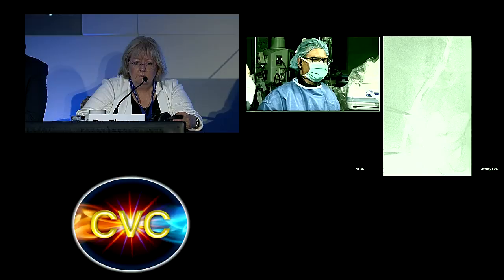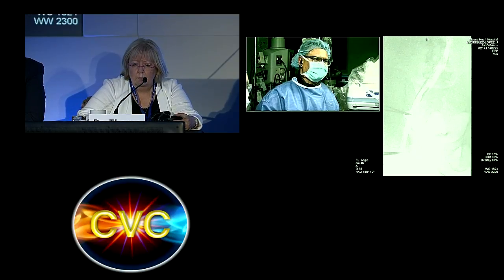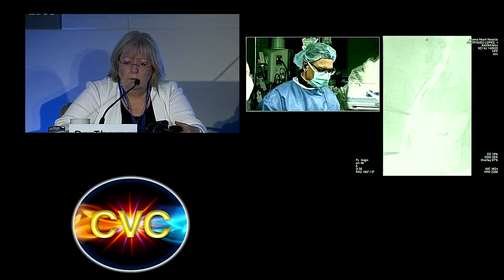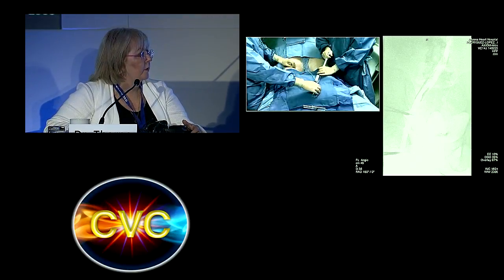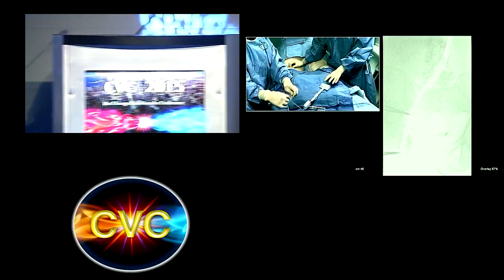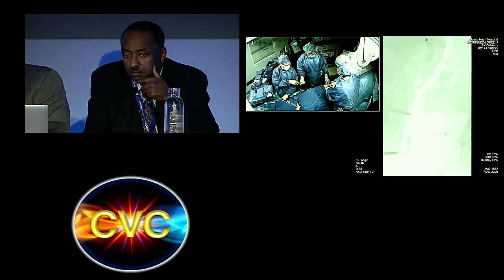It did fail to show much of it, except for the size of the external iliac right there. There was nothing that I can look at as a stenosis there. But definitely it's smaller in size right at that location. It's relatively small compared to the common iliac. Yeah. Any other comments from the panel here? I'm more likely to stent the iliac than the femoral. So if you stented the common femoral, I think stenting the iliac is actually more important.